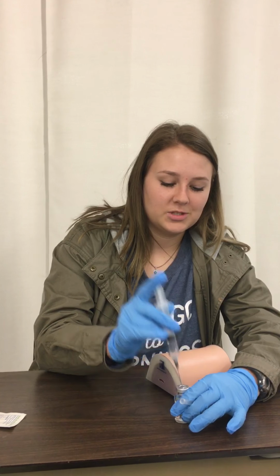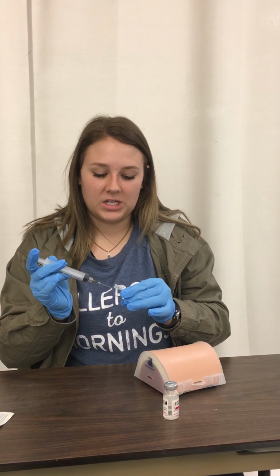You would assess, I'm going to put that medication back in. You would assess, I've got a lot of extra air in there, I'm just going to pull it out. Okay, you would assess the patient, ask how they're doing, inspect the site to see if there's any bleeding, any discharge, anything like that. And then a little bit later after you give the injection, you're going to want to check and make sure that it is being therapeutic for the patient, that it's actually working and doing what it's supposed to do. And then you can put a Band-Aid on it if you want to. And then that's that.